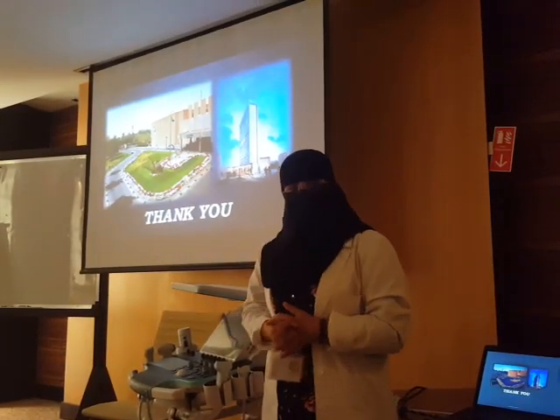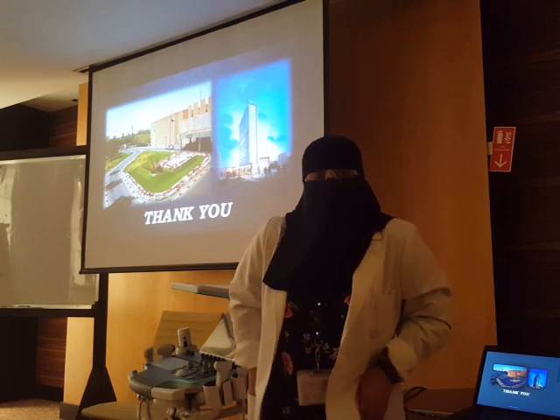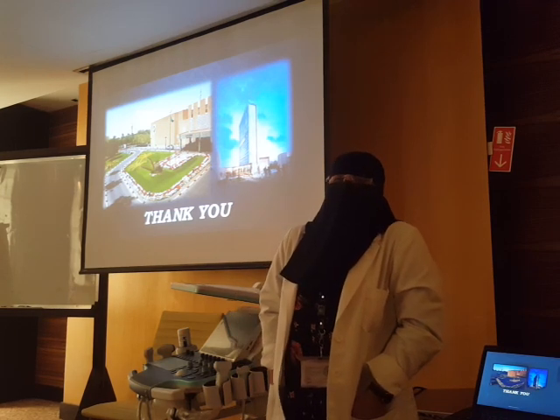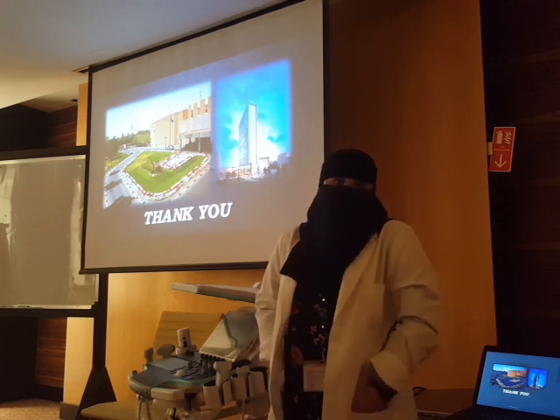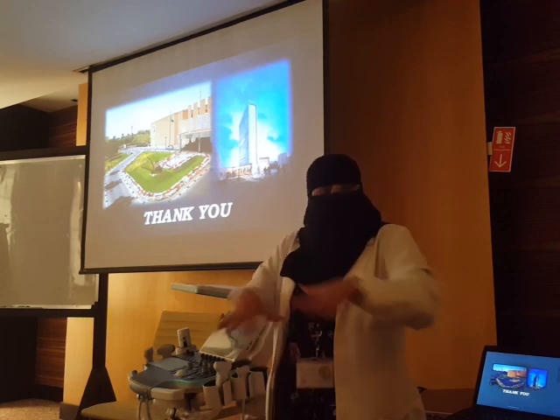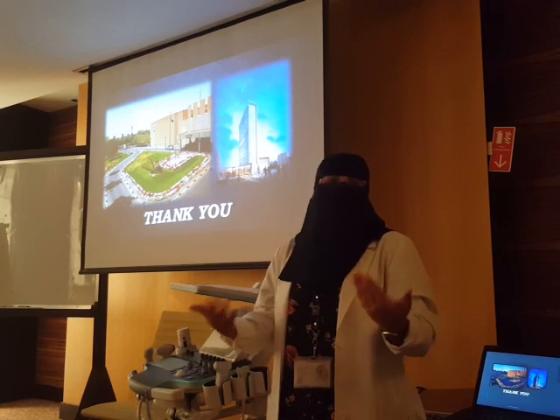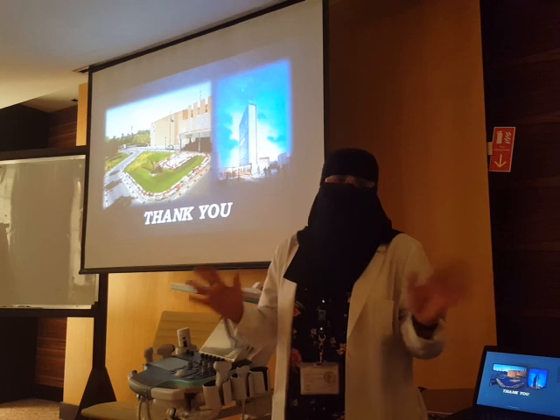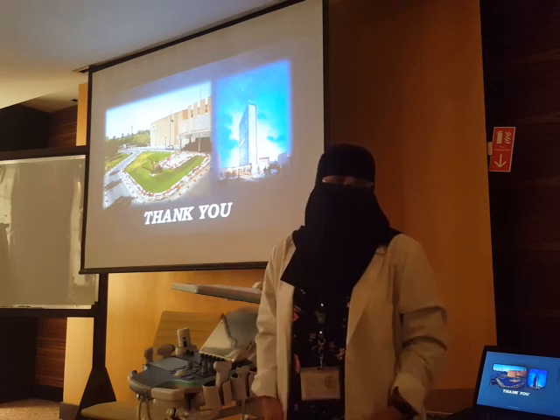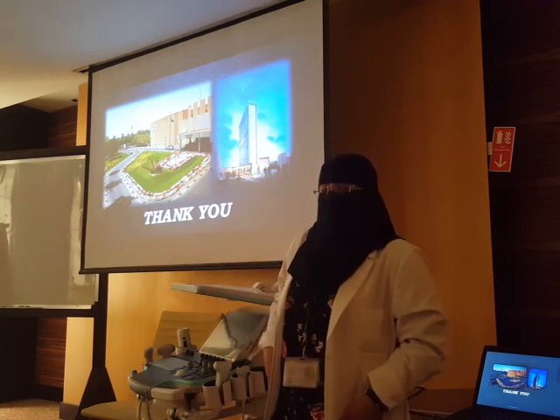تمام. الباول فقط للإنفانت أو children ما ينفعش الأدلت خالص؟ الأدلت, it will be a limitation, لأن the body habitus is different. Now we have muscles, fat, gassy belly. All of this will make it difficult to evaluate. But if the pathology is clear, you cannot يعني ignore it.